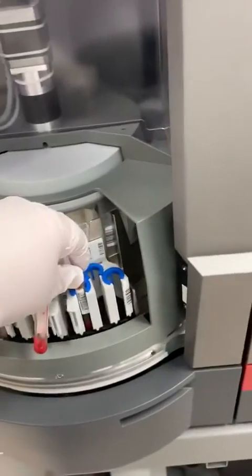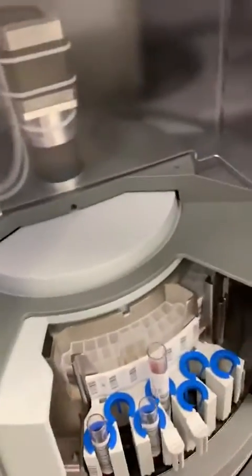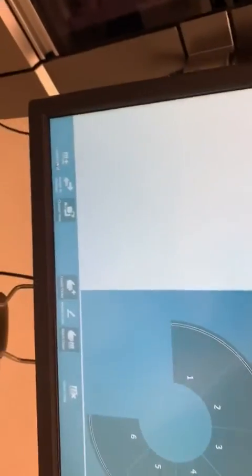You're going to have to make sure I'm positioning it, then you're going to wait until the machine recognizes it.